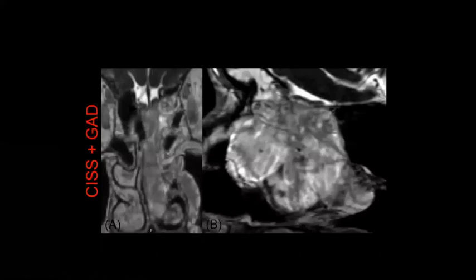This is a case with post-contrast CISS imaging. Here we're in the coronal plane through the nasal cavity and paranasal sinuses, and on the right-hand side in the sagittal plane. And you can see there's a mass here. This mass was actually dark on pre-contrast imaging. It's enhancing on CISS imaging, so it is in fact brighter than it would have been had I shown you the pre-contrast images.